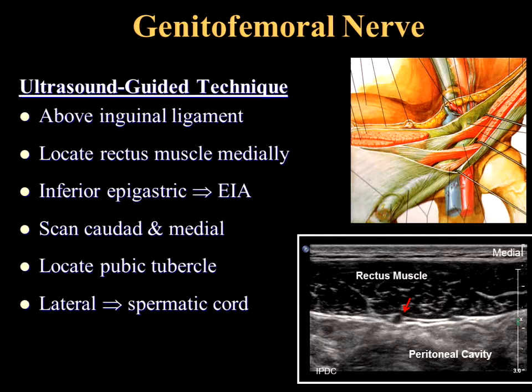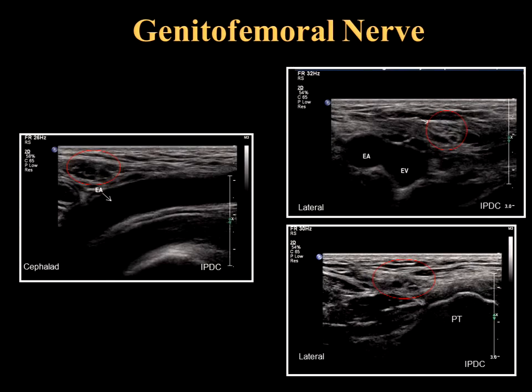Another technique: scan above the inguinal ligament, locate the rectus muscle medially, find the inferior epigastric artery, and trace it laterally and caudad as it dives into the external iliac artery. Once you find the external iliac artery, scan slightly medially to see the spermatic cord crossing over. You can also scan down to the pubic tubercle and look for the spermatic cord just lateral to it. In long axis you can see the external iliac artery with the spermatic cord right above, and the pampiniform plexus. In transverse axis you see the external iliac artery, external iliac vein, and the spermatic cord, and you inject both in and outside the spermatic cord.